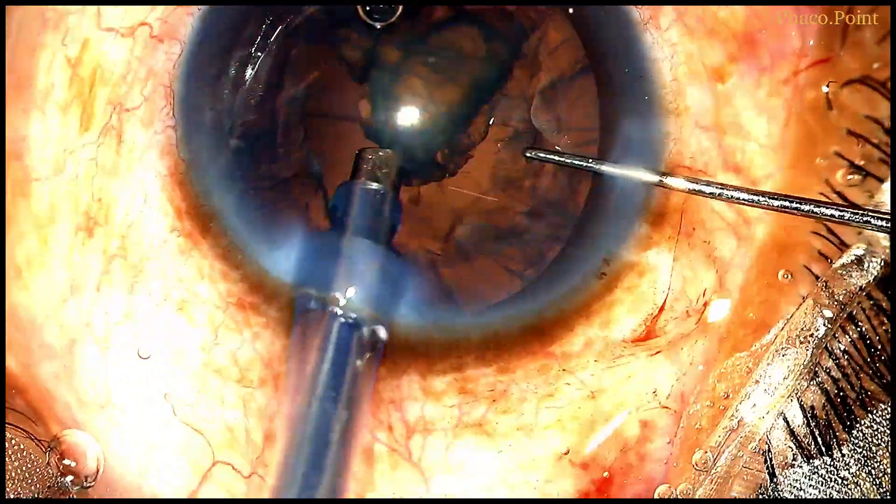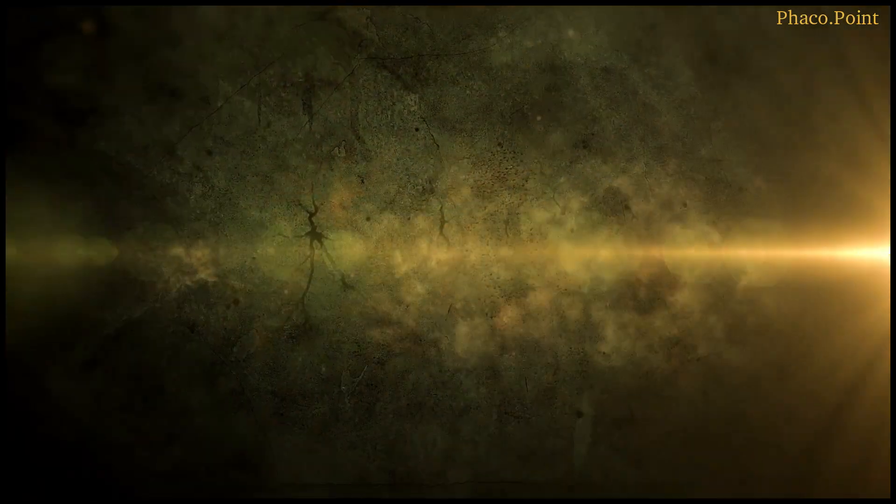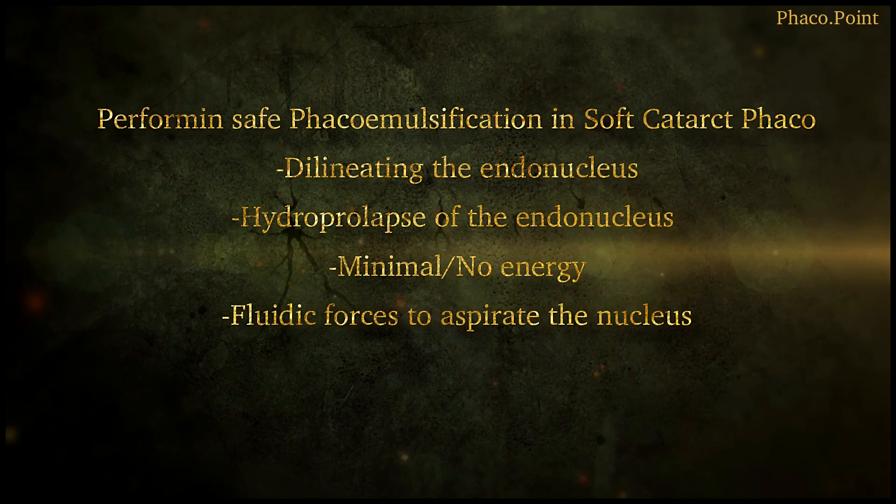As you can see, it took only about 15 seconds to aspirate this nucleus. To conclude: a hydro prolapse of the endonucleus partially into the anterior chamber prior to nucleus disassembly allows for a safe, quick, and easy nucleus management. I do hope you found this video useful. Thank you.